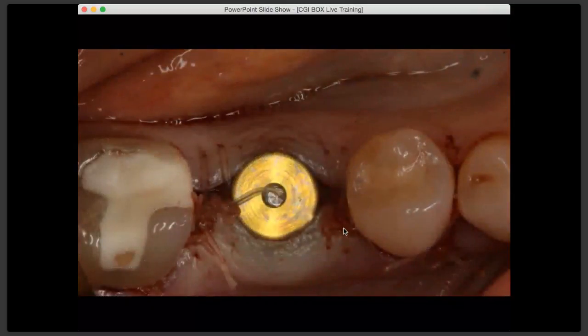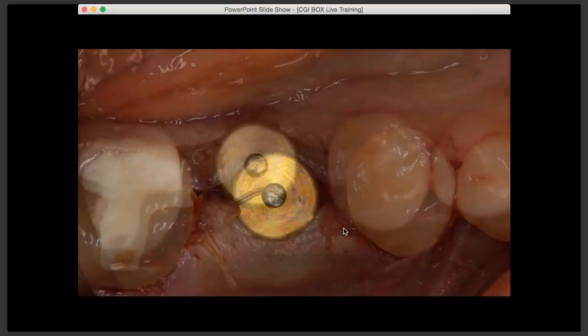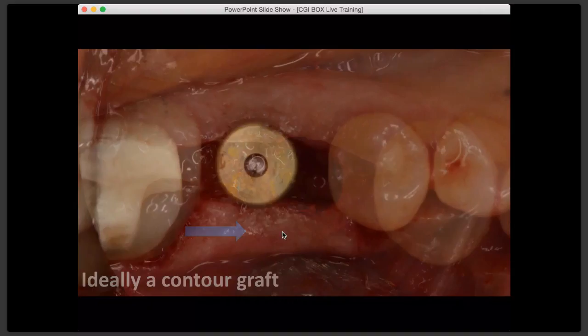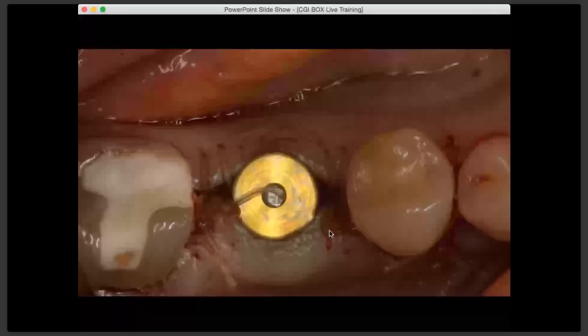And that's what it looks like when I sutured. But if I didn't, then I should have. And the way I would have done that, if I didn't, is place the implant, slowly resorbing bone graft material like Bio-Oss, and a membrane. And I've showed this in so many different videos. And it's really here as the flap adapts around the healing abutment.